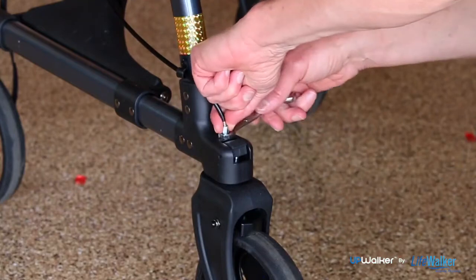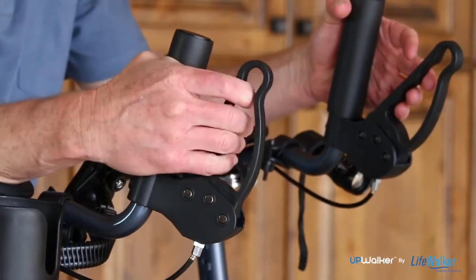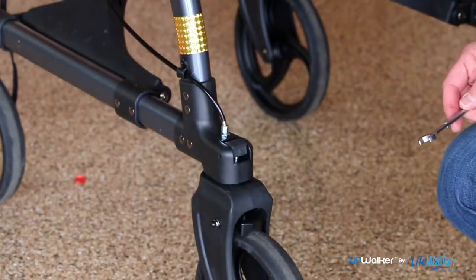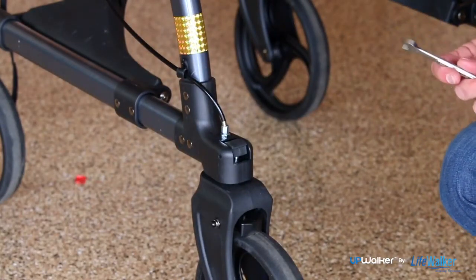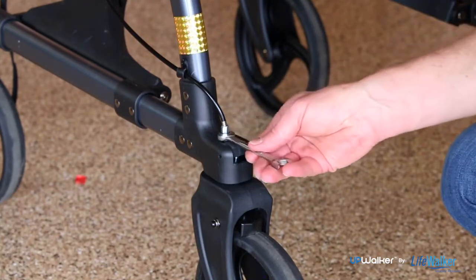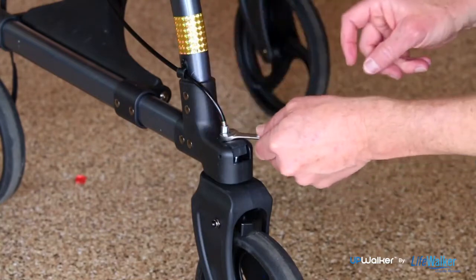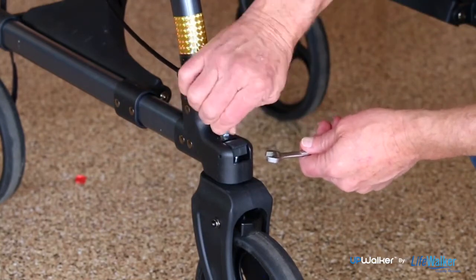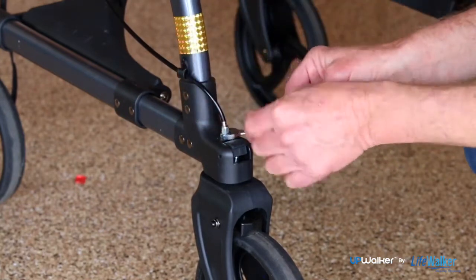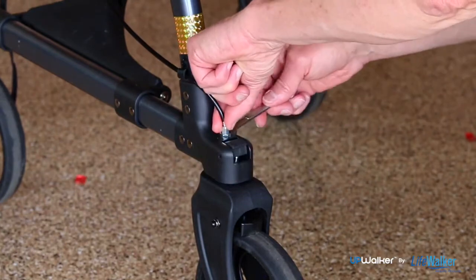Before attempting to adjust the brakes, ensure that the parking brake is disengaged. If the parking brake is too loose and you would like to tighten it, use fingers or pliers to loosen the small adjustment screw and use a 10mm or 13/32 wrench to loosen the larger nut located closest to the brakes. Then turn the adjustment screw a half rotation, counterclockwise.